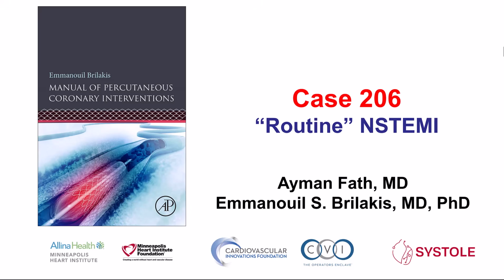This is a case of a routine non-ST elevation myocardial infarction that posed some procedural challenges.